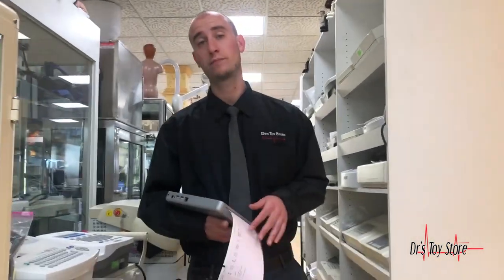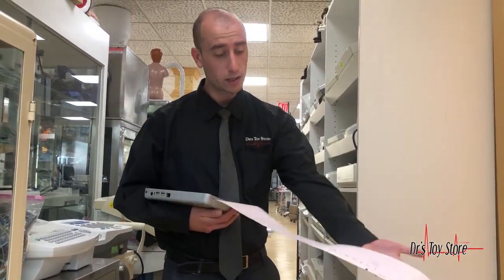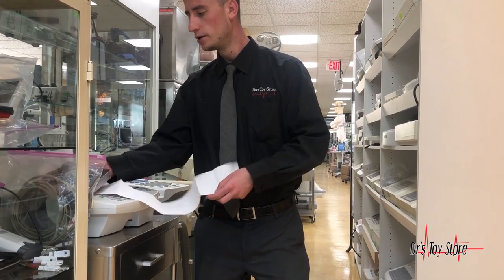The idea behind this EKG is a paperless platform. It has Wi-Fi that connects directly to your computer and can transmit to your EMR system. If your computer is able to transmit that way, you bypass DICOM — you don't have to worry about it anymore — and you don't have to waste money on expensive thermal paper.